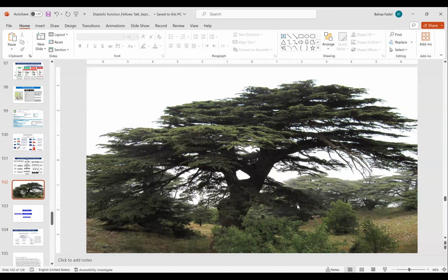Septal E over E prime is normal, but lateral is abnormal. In cases where one is normal and the other is abnormal, what should we do and how can we report such cases? Okay, typically the septal E prime is more affected in disease than the lateral. It seems to be a bit more sensitive, and it drops earlier and more so than the lateral E prime.